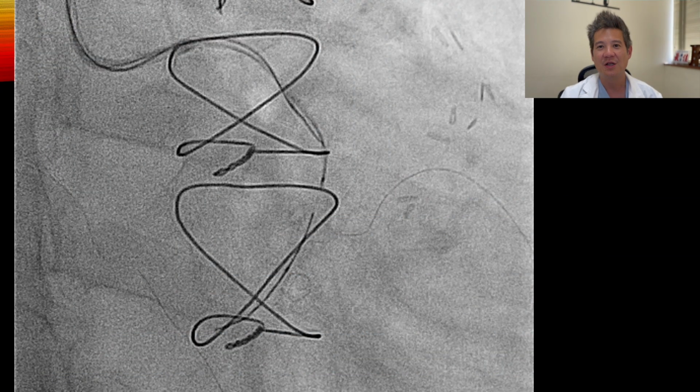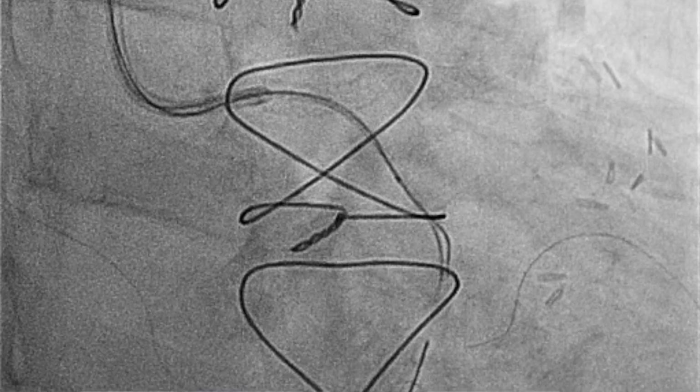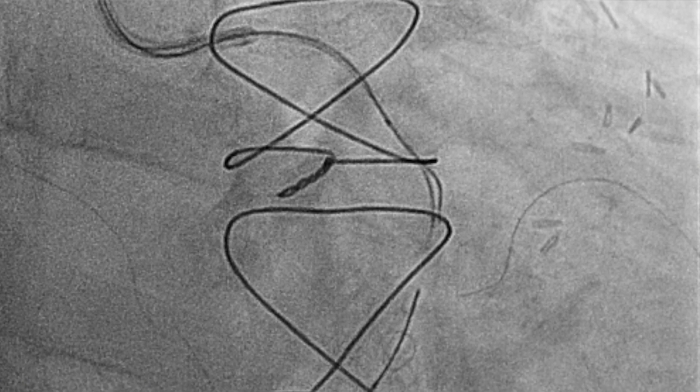I thought, let's start treating him properly and try to do the CTO. So since I have an IVUS there, I decided to go for IVUS guided wiring. With a Guyanix 4 wire, I repunctured the proximal cap, and this time I managed to get a puncture into this true intraplaque space, but not the true lumen.